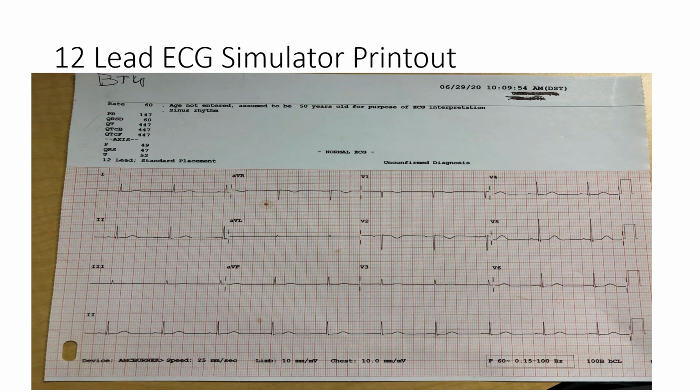And that's one of the key things I'm looking at on this ECG printout using my test equipment. And then of course, I'm going to measure that 1 millivolt square wave at the right-hand side. I'm going to count those squares and make sure. That's something that probably the doctor looks at too. If that was off, we would definitely hear about it in biomed. That would take like 1 second and they would know that. They probably know that better than we do. But the standard of the speed part, they don't have a standard to check that. That's what we're doing with our test equipment.